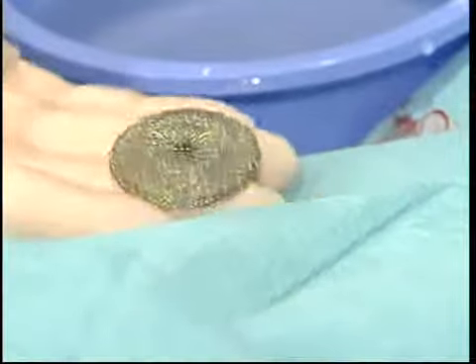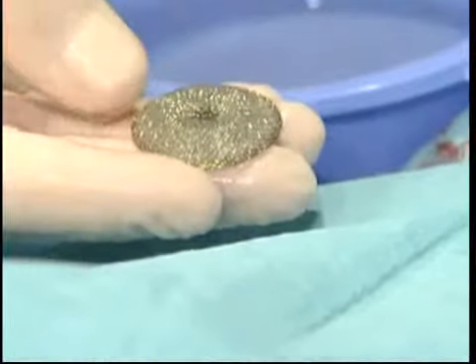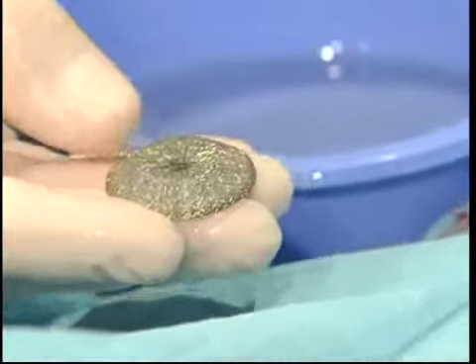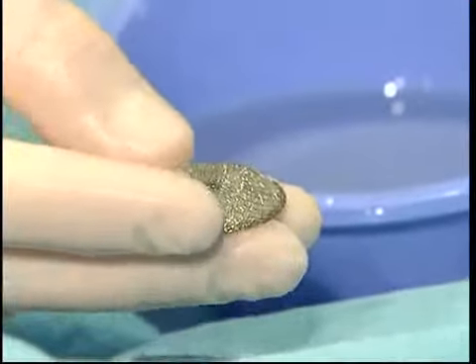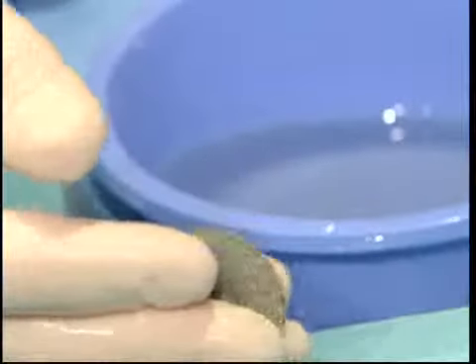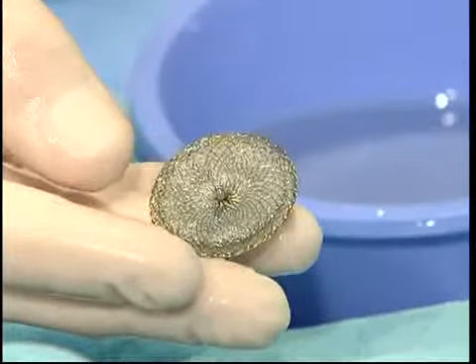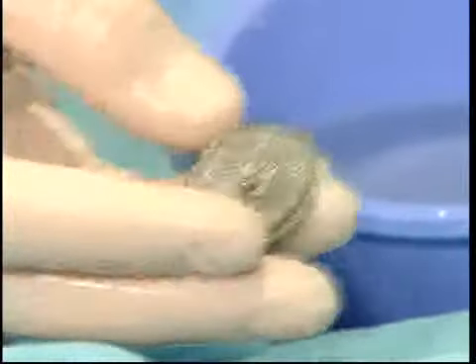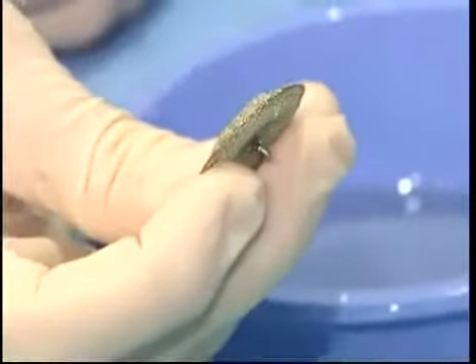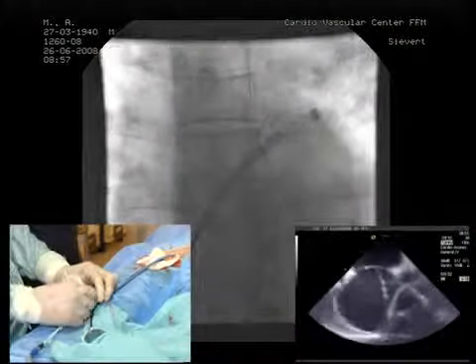Okay, here you go, chaps. You can see the device. You're looking at the left atrial aspect, and you notice the immediate discerning feature is the lack of the welded axle on the left atrial side. If I turn it over, you can see there is a relatively low profile screw hub on the right atrial disc. And in profile, the device looks very nice, as you can see. So there is the device. Let me just finish this and we can take some questions.